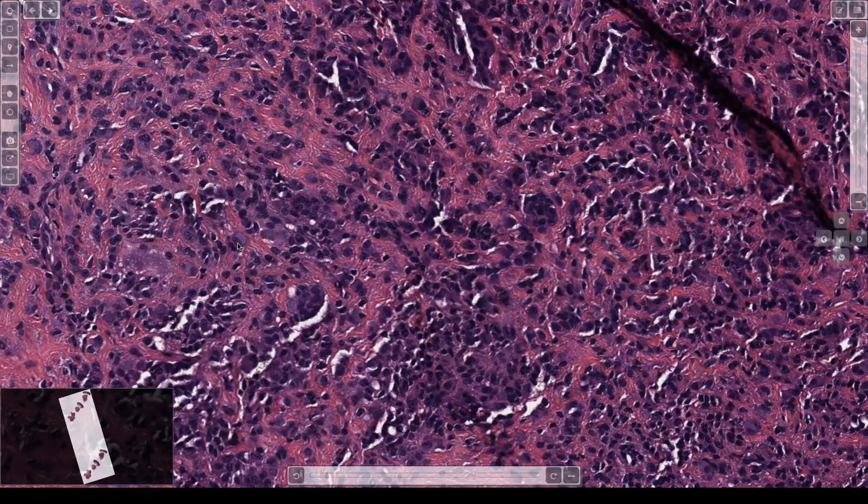This is really characteristic of giant cell tumor of tendon sheath. Don't go hunting for giant cells right away — it is a good way to learn them, but there are examples that don't have any giant cells or have very few. If you don't learn to diagnose these with all the other features, you'll be in real trouble when you have a frozen section with no giant cells. If the patient has a history of cancer, a PET-hot nodule, mitoses, and rhabdoid cells, and you say probably metastatic carcinoma — you'll be wrong, because they are often mitotically active and hot on PET.